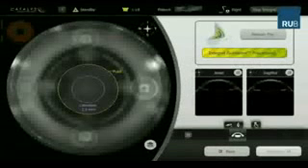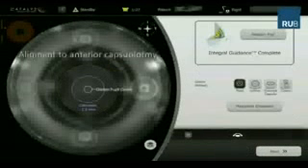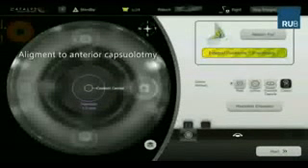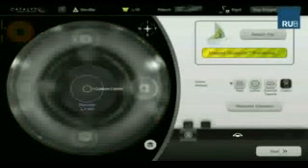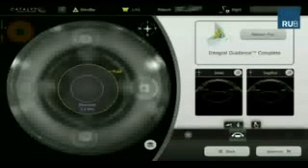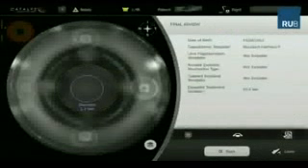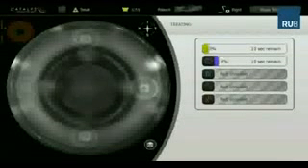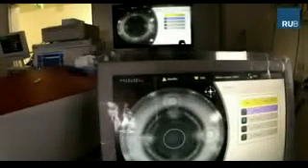The posterior capsulotomy is individually aligned and centered to the anterior capsulotomy and the position reconfirmed. The laser creates the posterior capsulotomy as if it is an anterior capsulotomy. In this case, it starts in the vitreous anteriorly, and the cavitation bubbles around the floating capsulotomy can be observed on the infrared camera. After undocking, the patient bed is swiveled to the side to continue the surgery under the microscope.